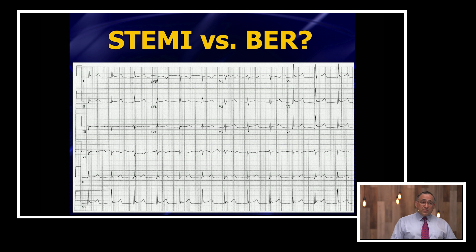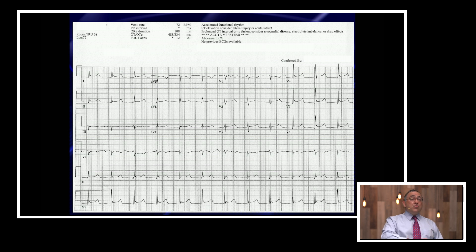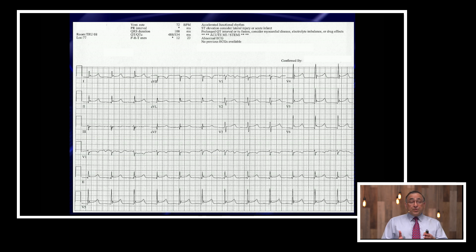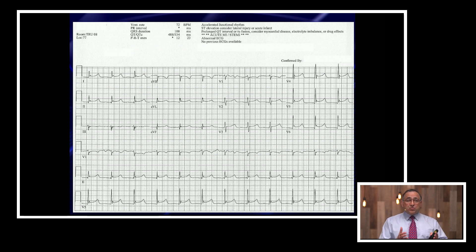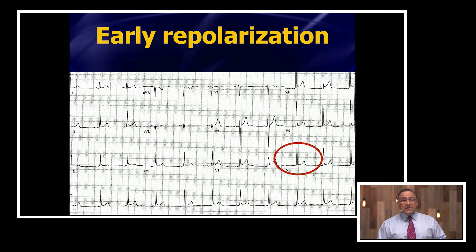The computer interpretation is suggesting that this is a STEMI. So you could go ahead and activate the cath lab and let the cardiologist figure it out, which would be totally appropriate. Or you could get a stat echo or do a POCUS yourself. I'll admit I am not good enough to reliably distinguish early repol versus STEMI on echo. So with just the 12-lead ECG, is there anything you can look at to reliably help make that distinction?